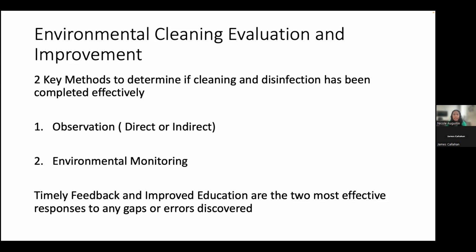It's also important that timely feedback and improved education are the 2 most effective responses to any gaps or errors discovered. So when you're doing audits, and you see somebody committing an error, it's important that you correct them right on the spot and not a week later, because they're not going to remember what they did.